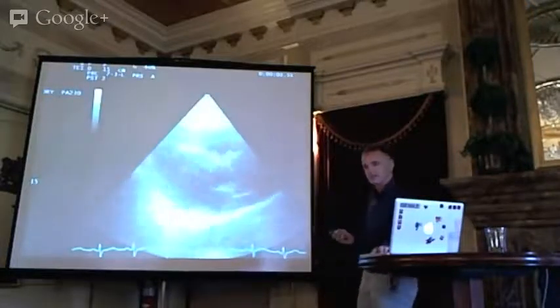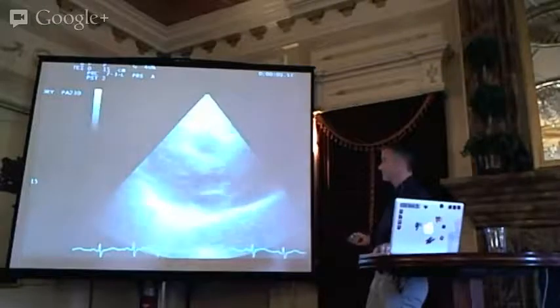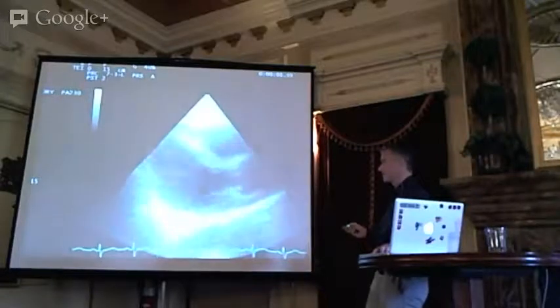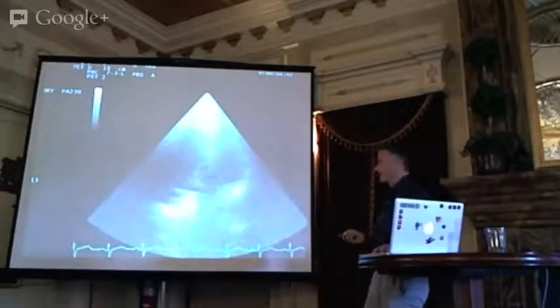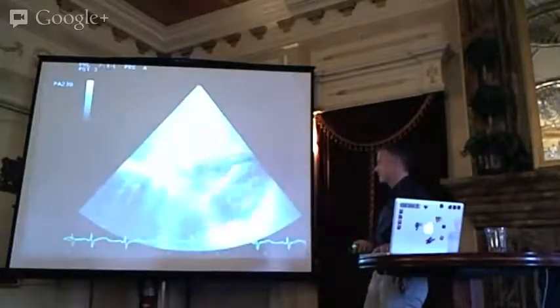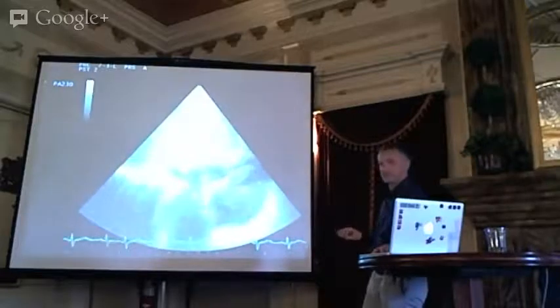Now these are crappy scans, because this is the real world. Very big obese patient. In terms of the parasternal long axis view, no fluid around the heart, no big RV. Actually, quite busy, isn't it? Very vigorous. Apical four chamber view, good up-down movement of the main valves and the ventricle looking quite busy. Subcostal view, not too bad. That doesn't scream pump failure to you, does it?